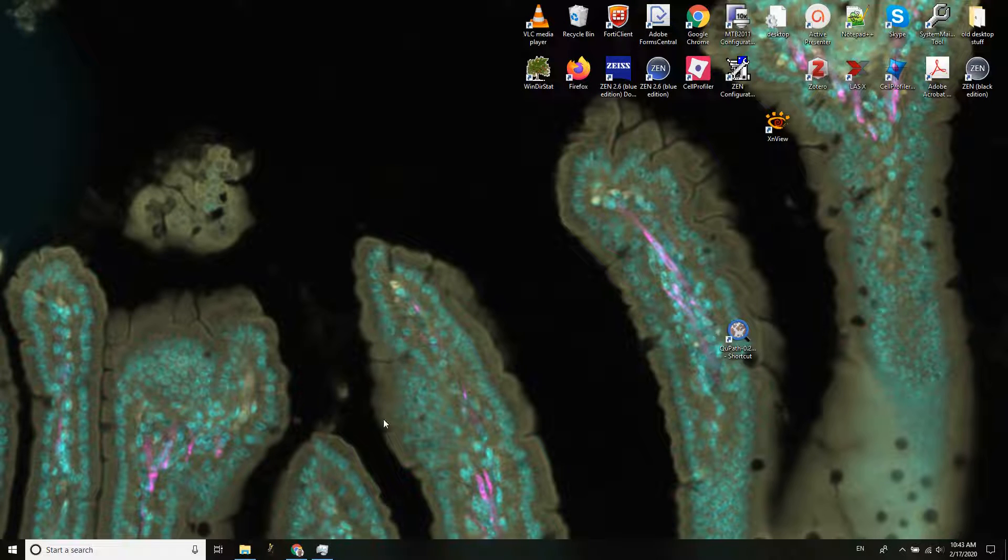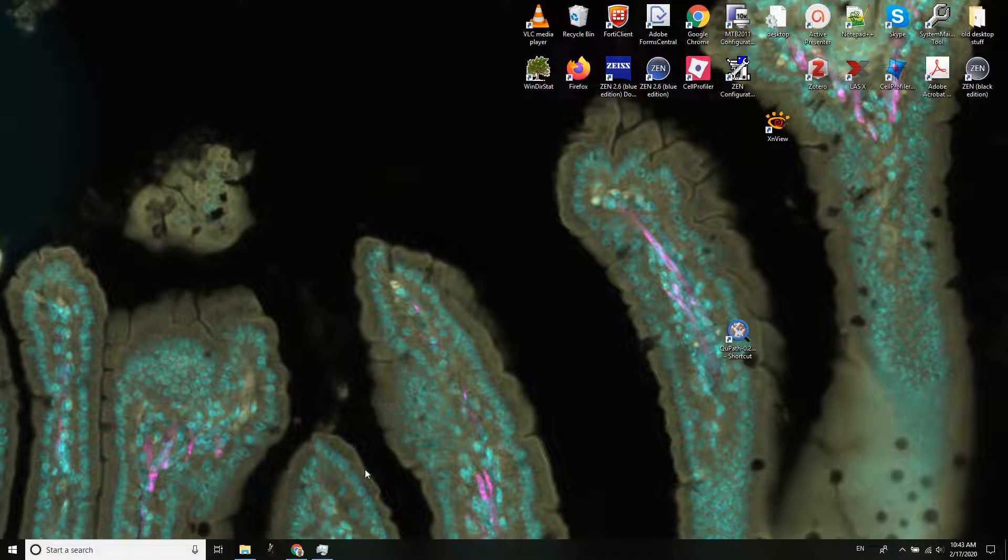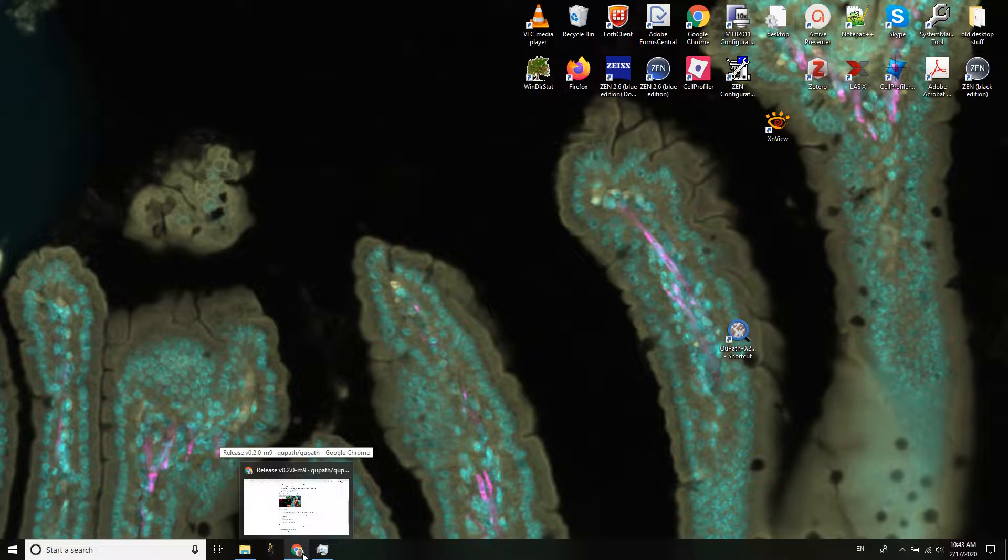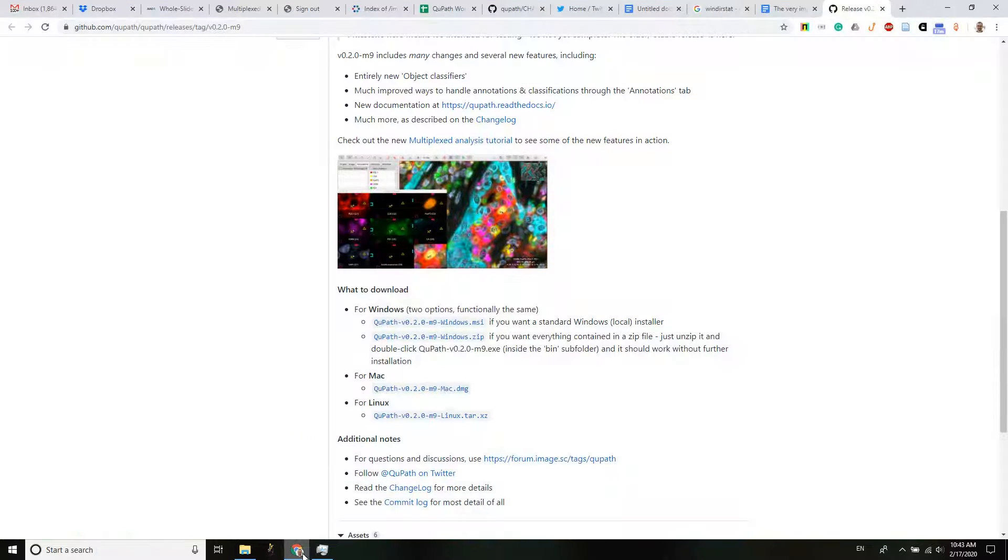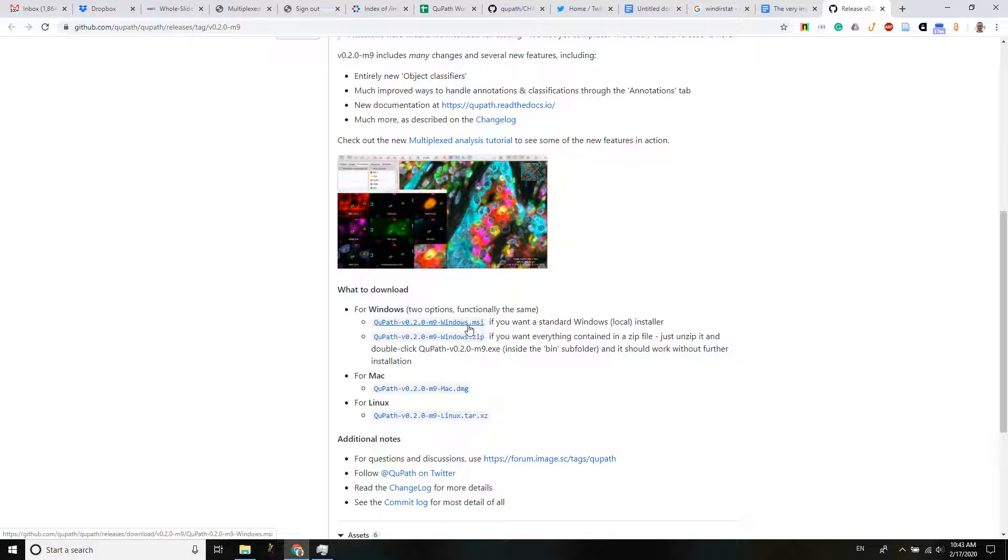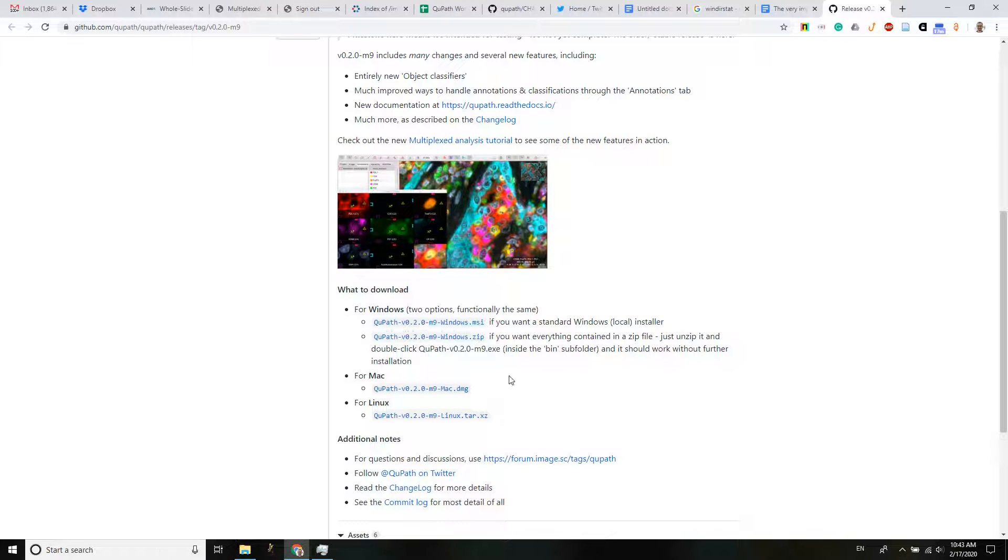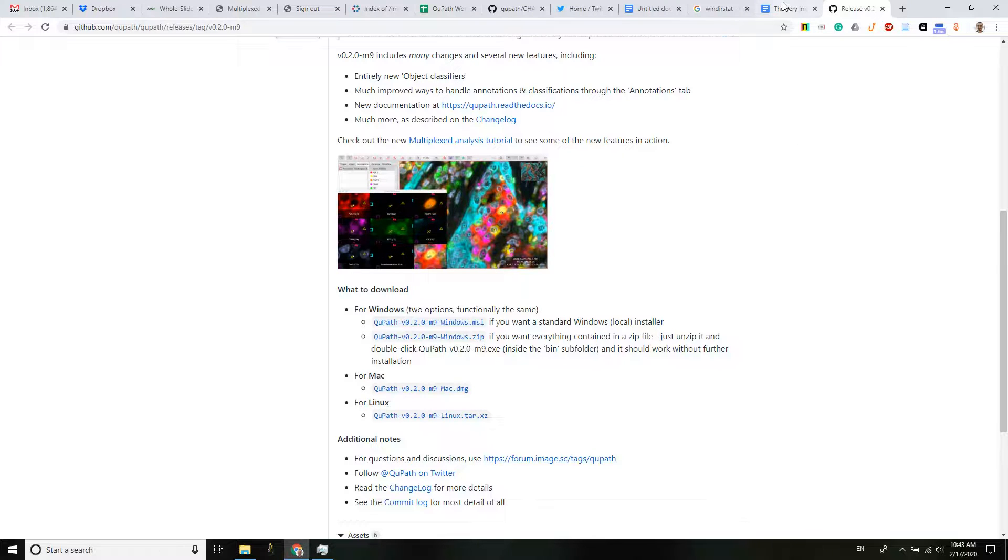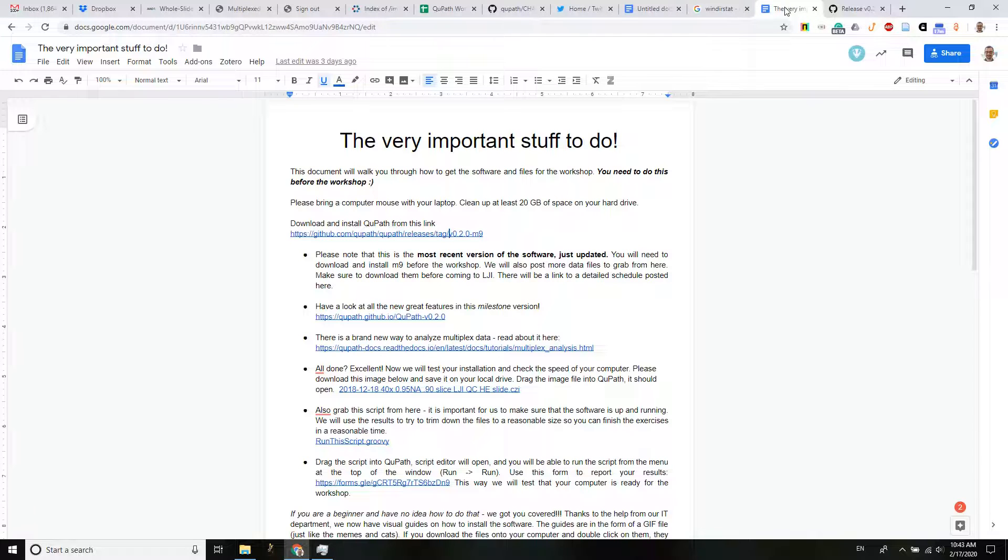And we have QuPath up and running on a Windows computer, and this method did not require installation. So if you have any problems with enhanced security on your computer, that's the way how you can get it on. For everybody else, you can get the standard Windows installer. This will conveniently create shortcuts on your desktop.